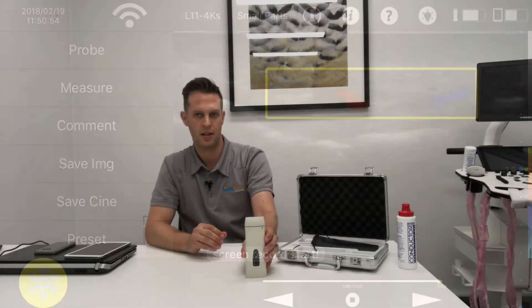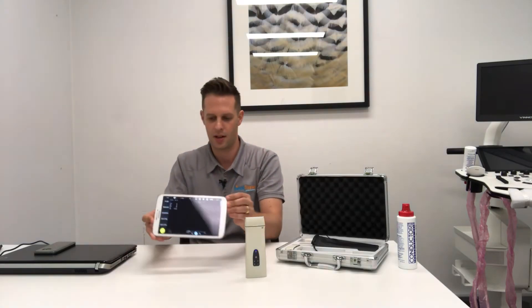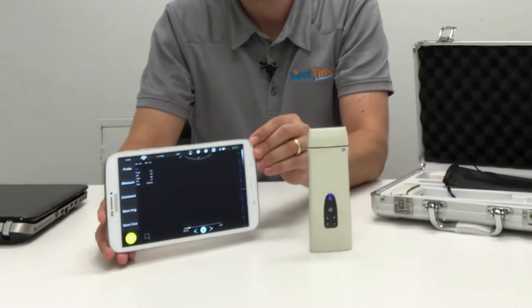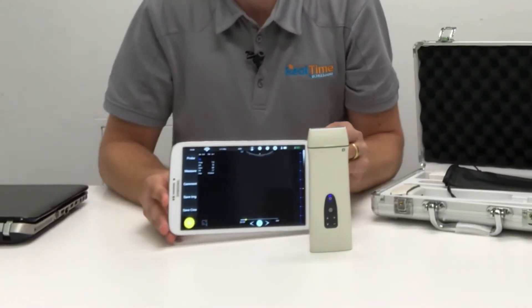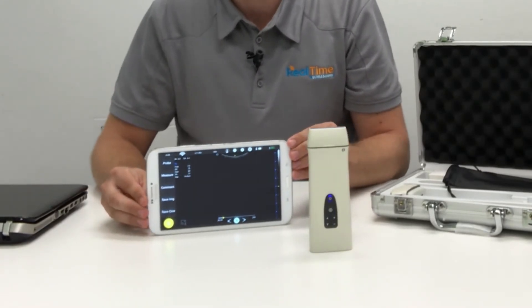In terms of connectivity, you can connect this device to Android, iOS, and Windows devices. At the moment we've got this connected to an Android tablet and this is the software that you can see. We'll run through the software and give you a look at all the different features.